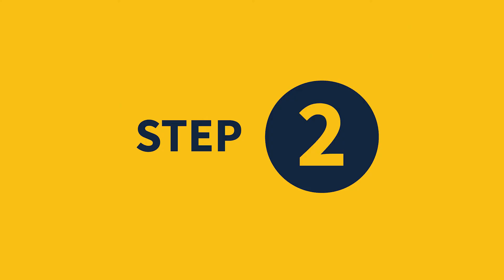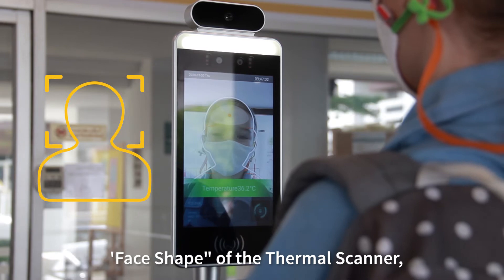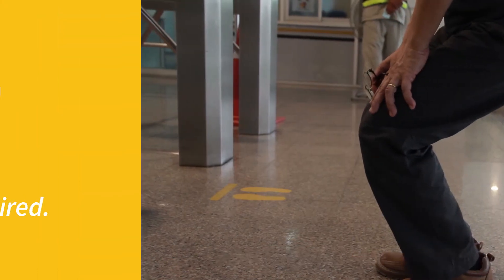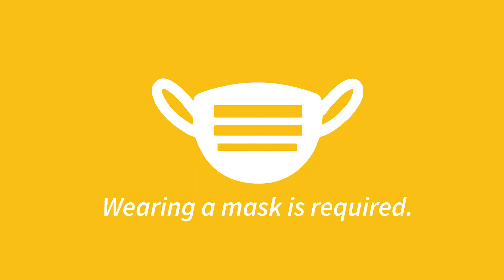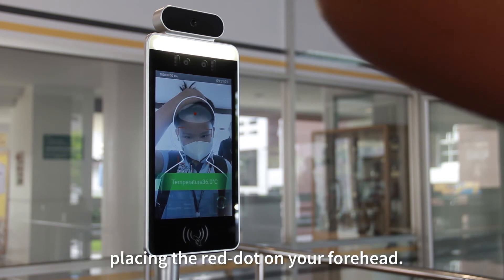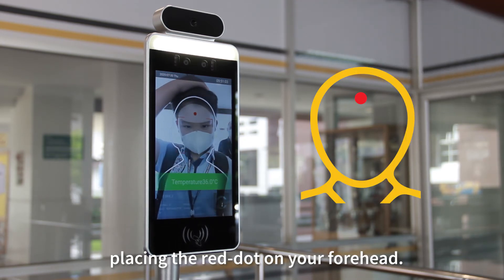Step two: make sure your face is covering the face shape of the thermal scanner. Bend your knees if necessary. Wearing a mask is required. Be sure to remove your hair from your forehead, placing the red dot on your forehead.